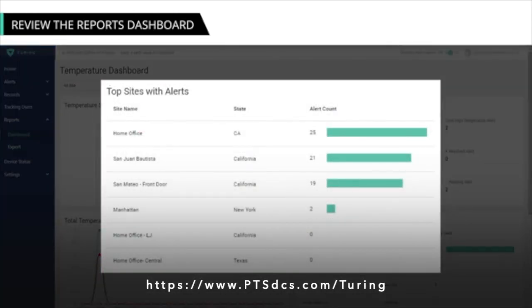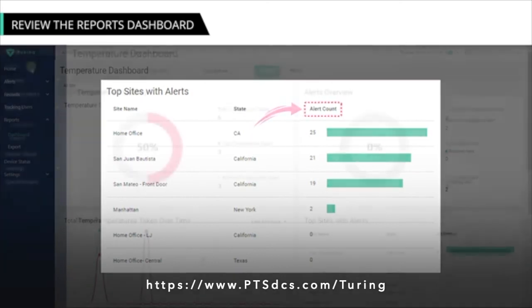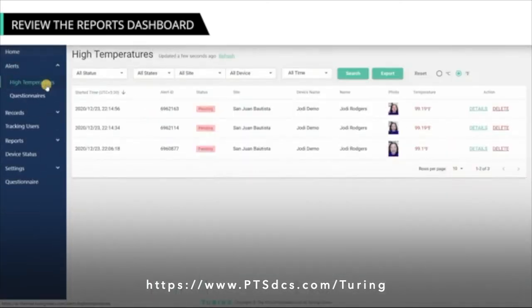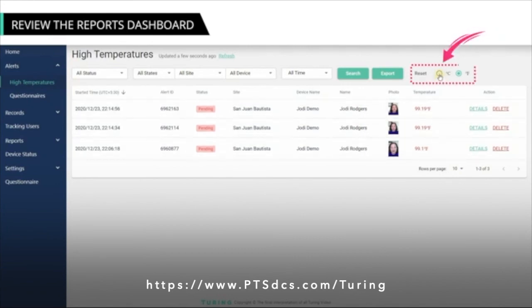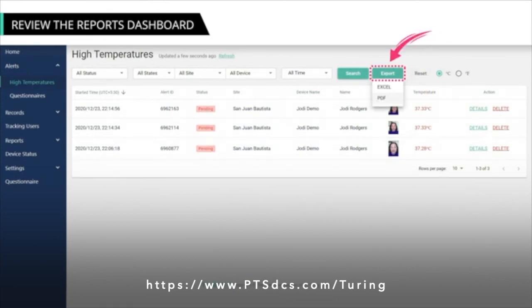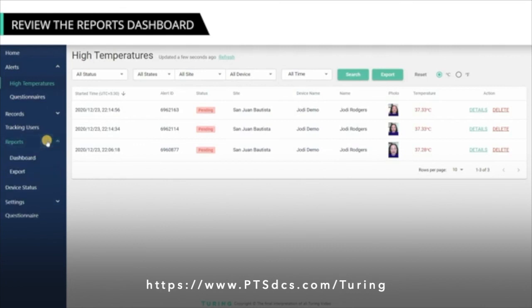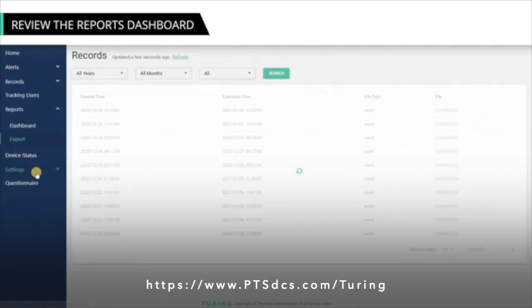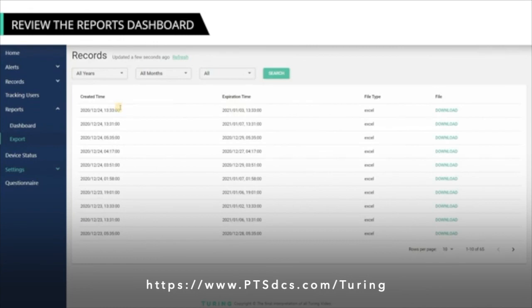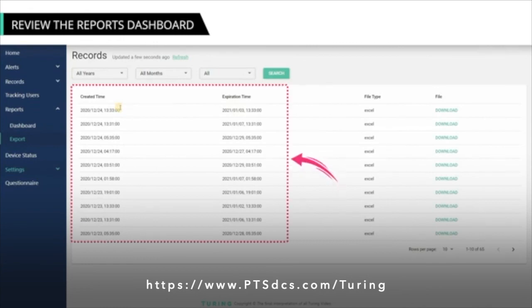The Top Sites with Alerts section displays sites and states with the corresponding alert count. On the High Temperatures page under Alerts, you can filter results and flip temperature between degrees Celsius and Fahrenheit. You can also export data to either Excel or PDF format, giving you a WYSIWYG report. You can access the Records page by clicking the Export option under the Reports menu. The Records page displays a list of daily reports of all data, visible to the administrator based on their role.